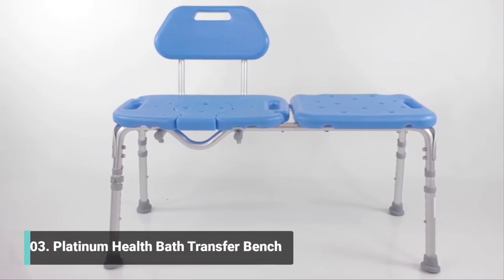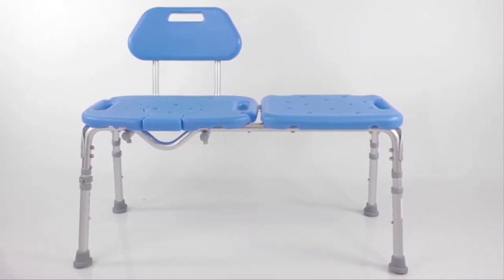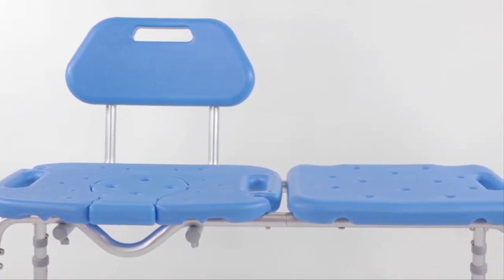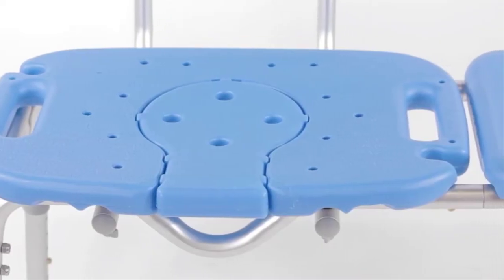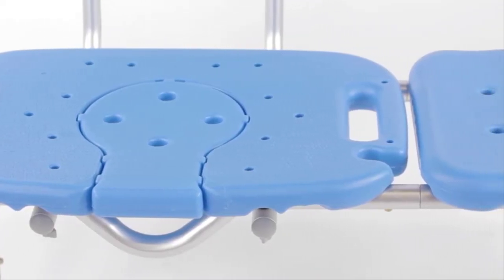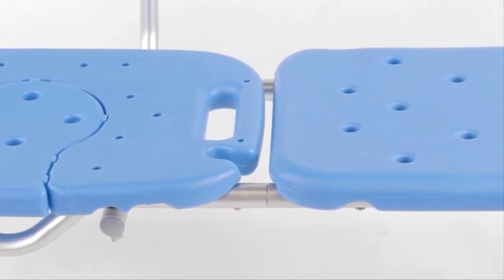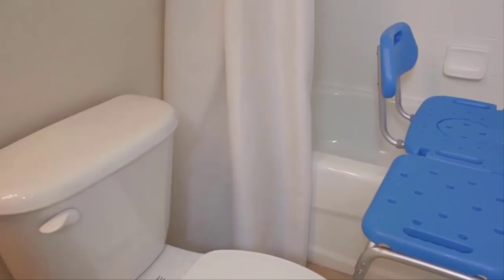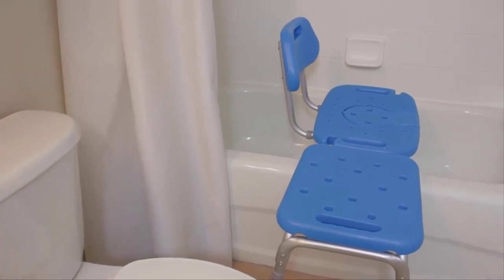Platinum Health invites you to enjoy bathing again with the All Access Transfer Bench with Cutout. For individuals with mobility, visual and/or cognitive challenges, safely accessing the tub or shower can be a daunting and often dangerous process. The All Access was designed by a team of dedicated healthcare professionals to help bring comfort, safety, dignity and pleasure back to bathing.